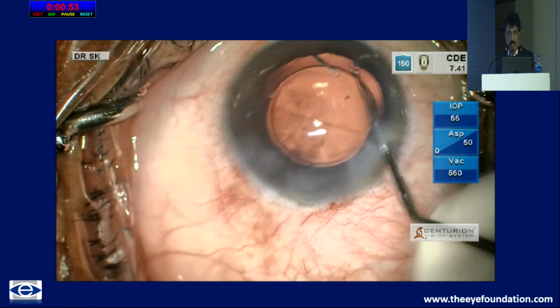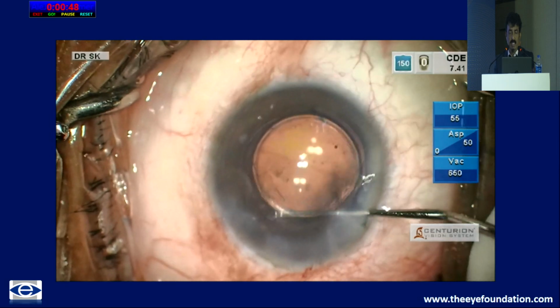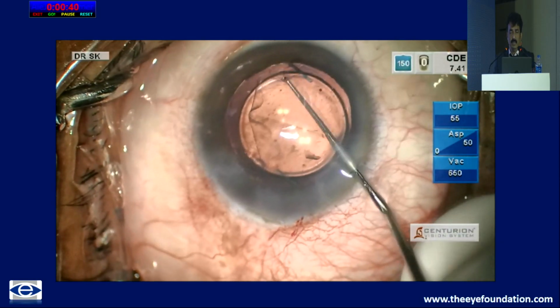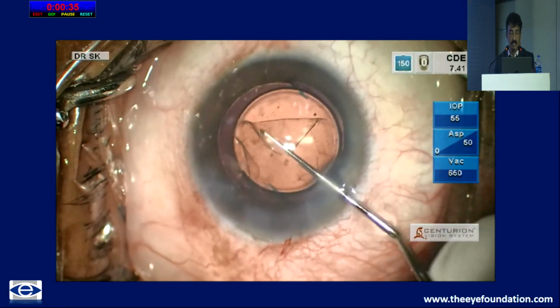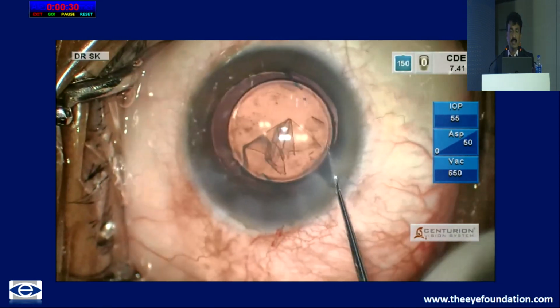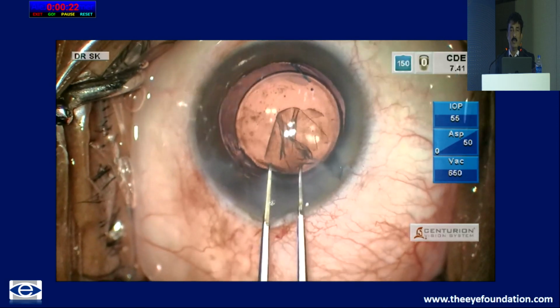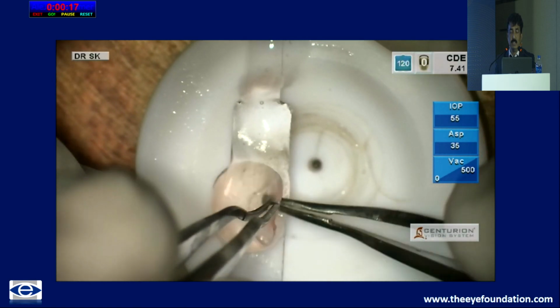Descemetorrhexis, stripping of Descemet's, has to be done in these cases because the endothelial Descemet's complex is thick here because of the abnormal collagen deposition. In some cases like chronic PBK, I usually don't do a descemetorrhexis, but in this case, I do it. See to it that it is not extending to the periphery. Sometimes the graft area will be clear cornea, but in the periphery you have bullae that will be disturbing for the patient. So see to it that it doesn't extend to the periphery.